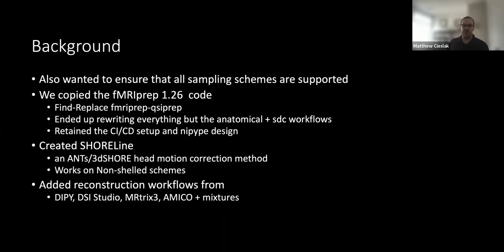So reconstruction workflows where we go across these different software packages such as Dipy, DSI Studio, MRTrix, and AMICO, and you can put them together in a config file and mix and match them. So you can do reconstruction in Dipy and then tractography in DSI Studio, or reconstruction in MRTrix and do tractography in DSI Studio, and mix and match. It's one of the more fun things to do, and there will be some examples of that at the end of it.